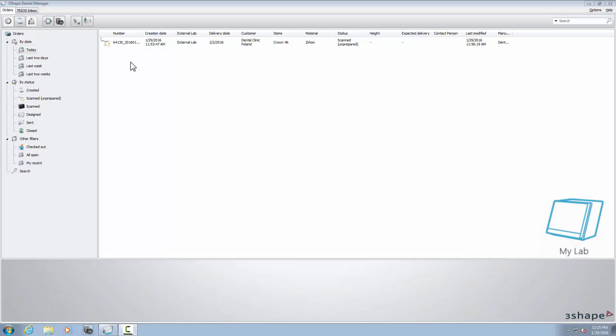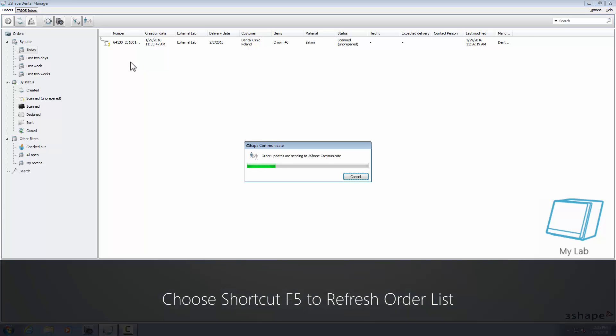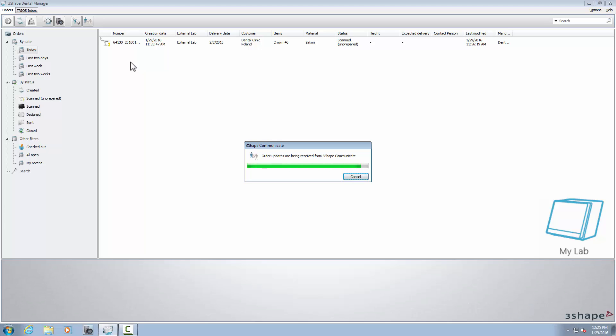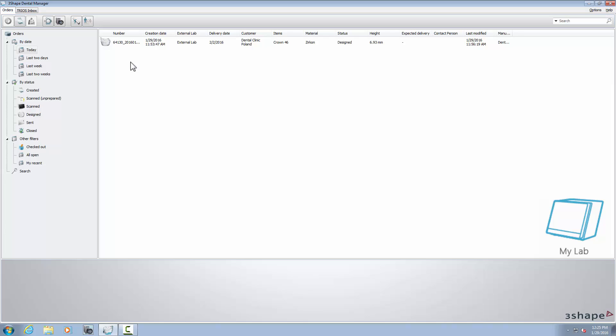Now we are back to the work lab. TRIOS Inbox is refreshed automatically every few minutes, but you can also refresh the orders list manually with the F5 shortcut on your keyboard or with the Refresh button in the main menu.